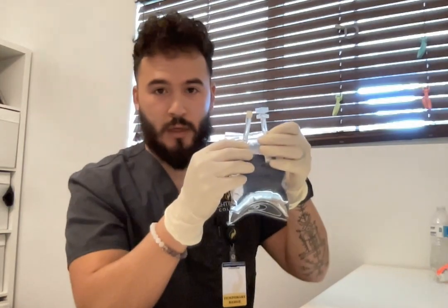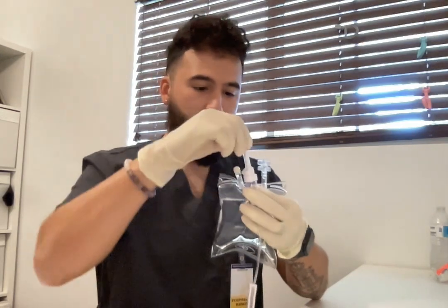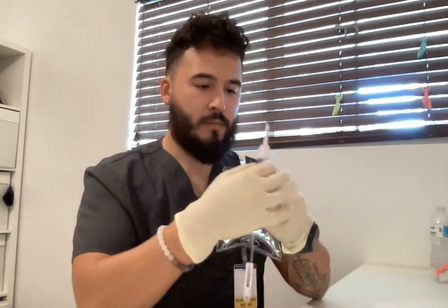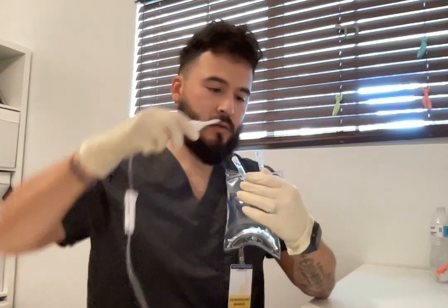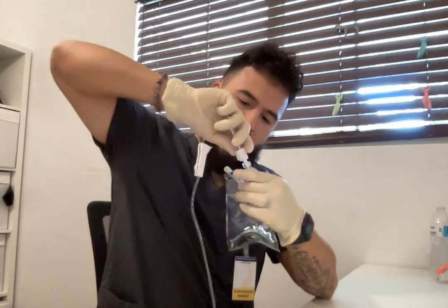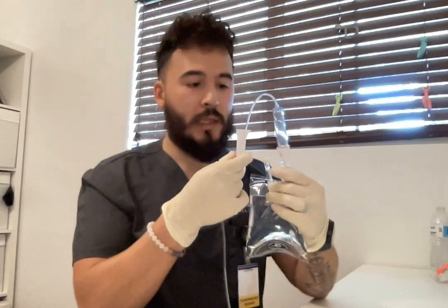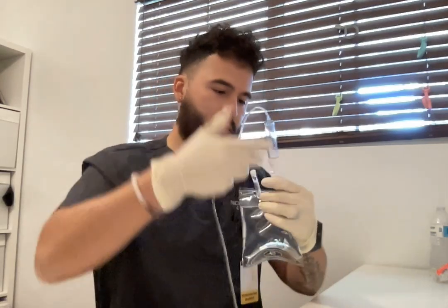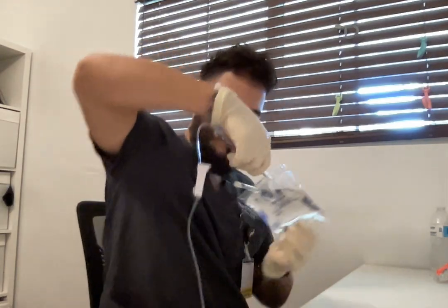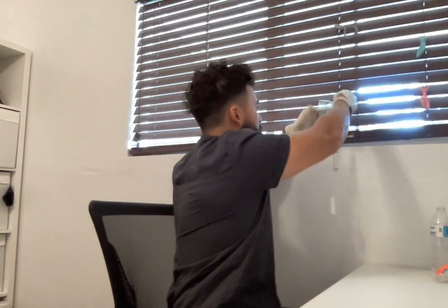So I have my medication. I have my primary port here. So like I said, I already removed the cap on this. So remove the cap, have the sterile spike. I'm going to insert it all the way. I want to make sure that I have my clamp fully clamped. So then now I can hang it. So I'll hang it right here.